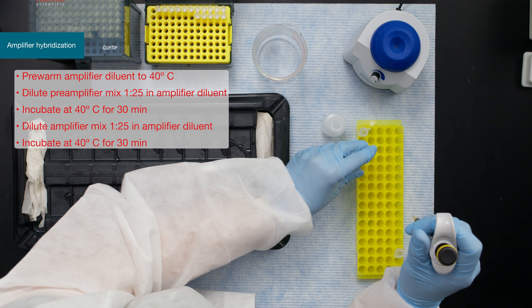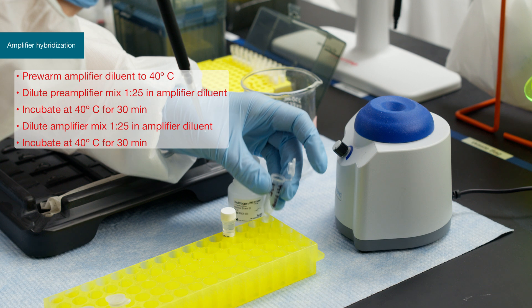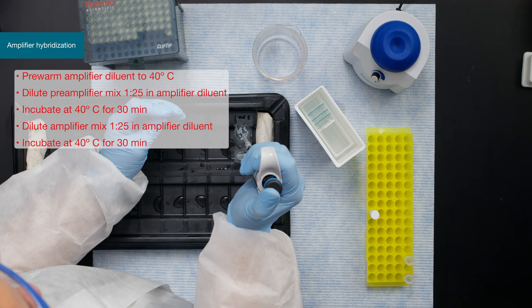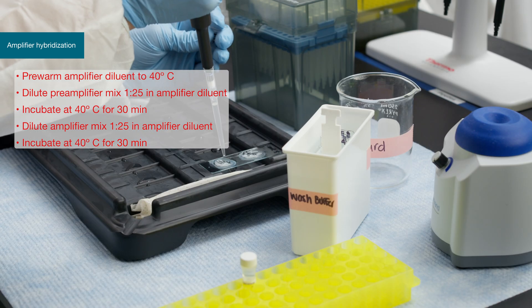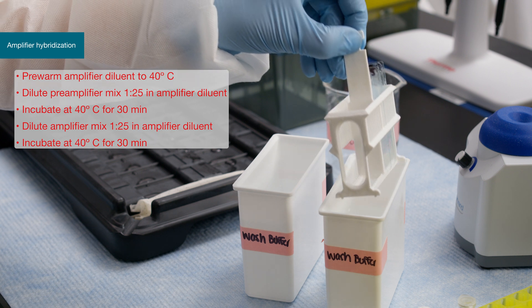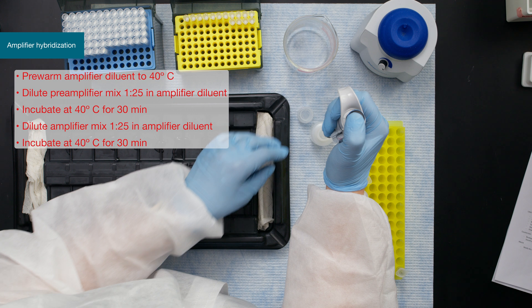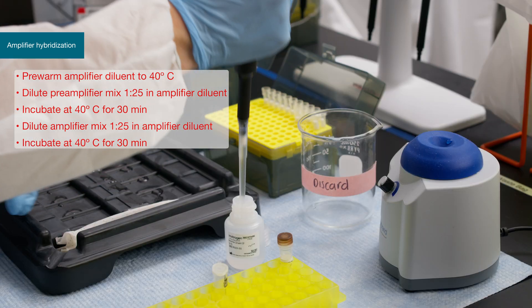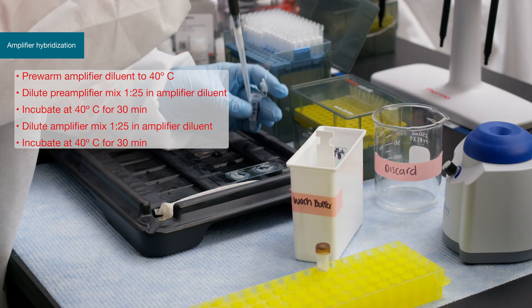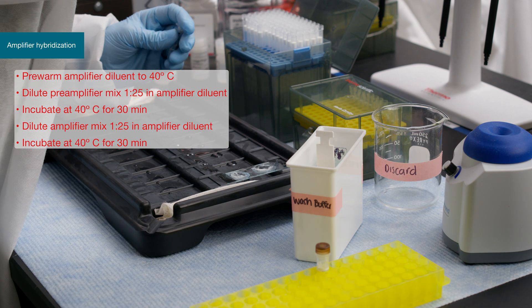The pre-amplifier mix should be diluted in the pre-warmed amplifier diluent. Cover the tissue sections with 400 microliters of the pre-amplifier mix and incubate in the oven for 30 minutes. Wash the slides three times and dilute the amplifier mix in the pre-warmed amplifier diluent. Add the working amplifier mix to the slides, covering the tissue completely, and incubate again for 30 minutes.